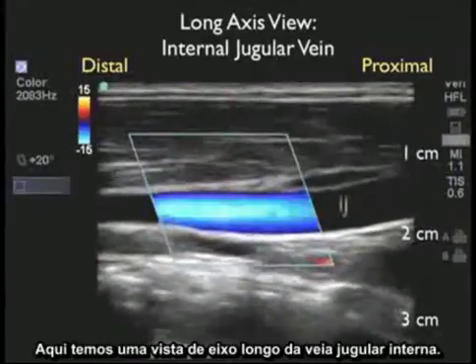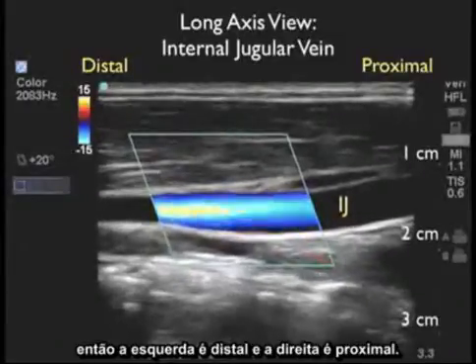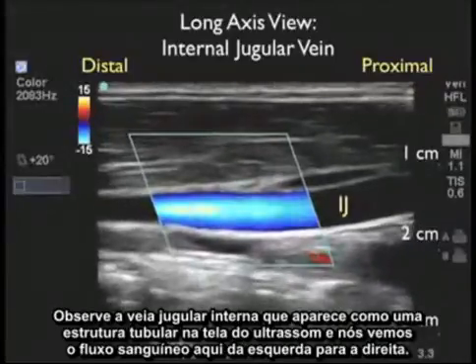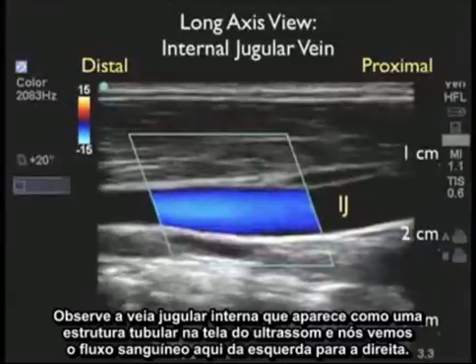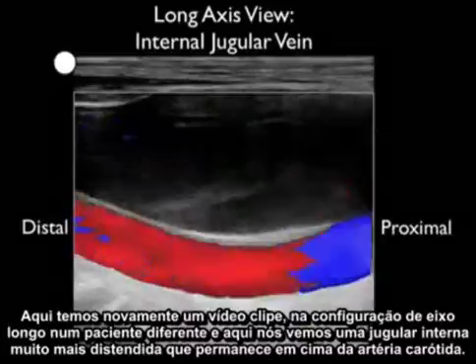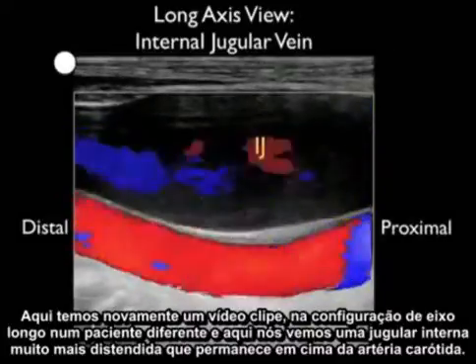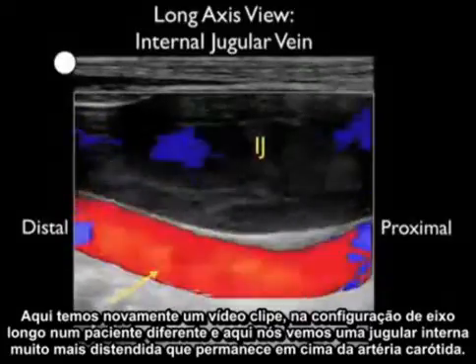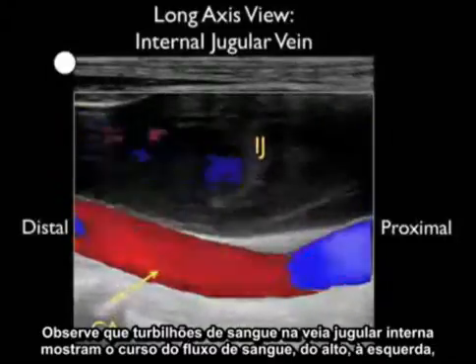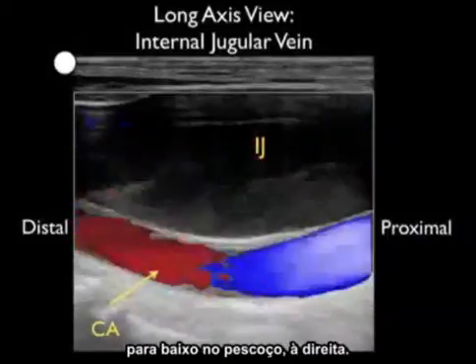Here's a long axis view of an internal jugular vein. I have the probe marker going more distally or superior within the neck, so to the left is distal and to the right is proximal. Notice the internal jugular vein appearing as a tubular structure on the ultrasound screen, with blood flowing from left to right. Here's a video clip of a long axis configuration in a different patient, showing a much more distended internal jugular vein lying on top of the carotid artery, with swirls of blood showing the course of flow from high within the neck on the left to low within the neck on the right.